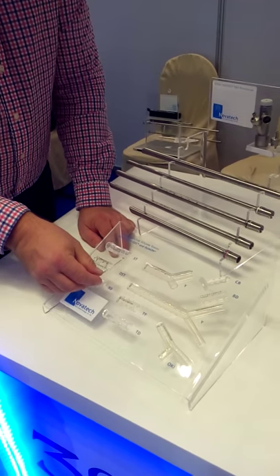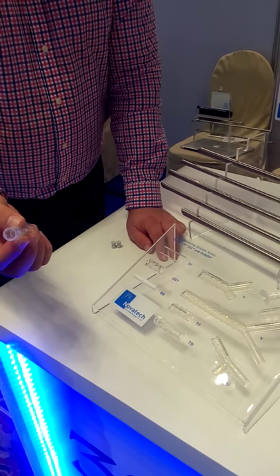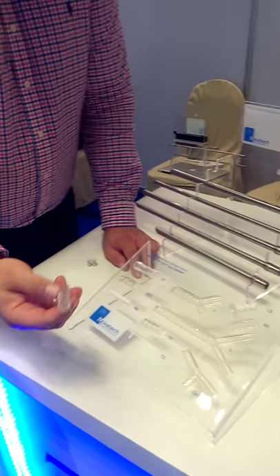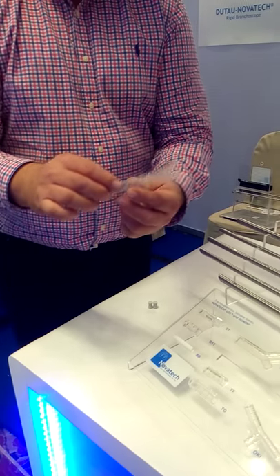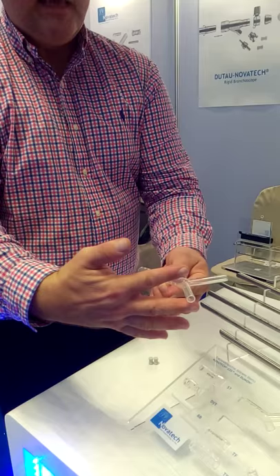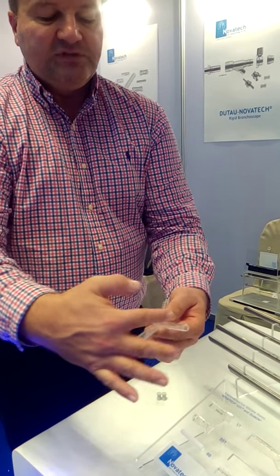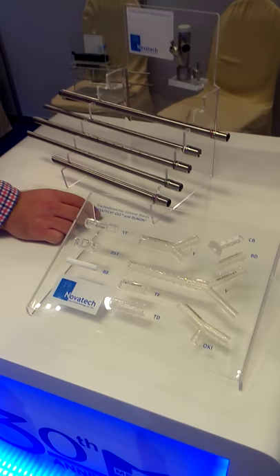All these stents come in different sizes. For example, there is the ST and DST stent for so-called hourglass stenosis — stenosis that has the shape of an hourglass. Then we have the normal TD and TF straight stents, and stents also come in a Y-shape. Different diameters up to 18 mm. These stents can be individually cut to your requirement — you measure the stenosis, cut the stent on both sides, and then place it with the so-called Ton placement set.